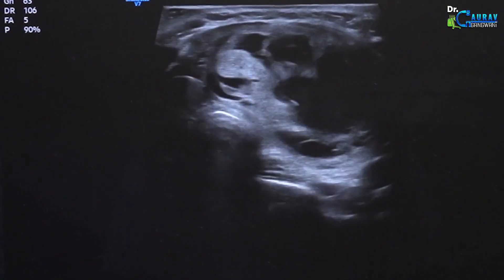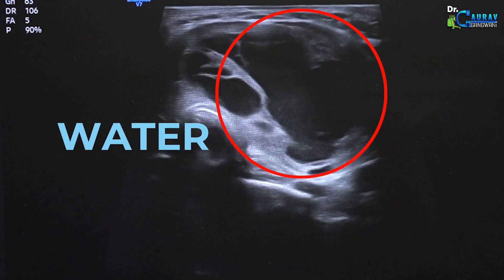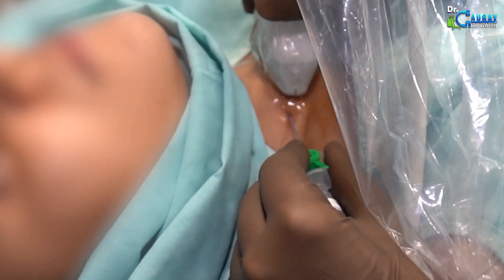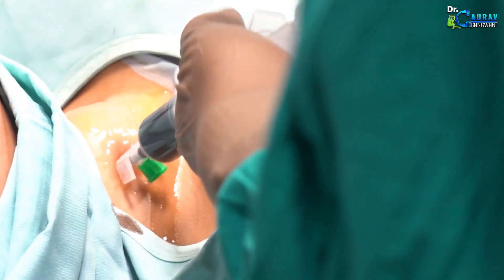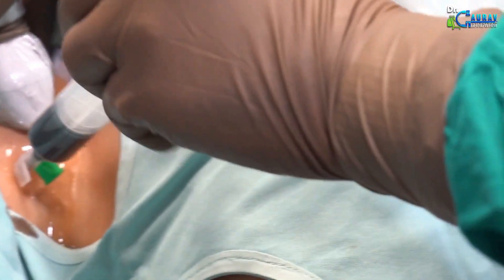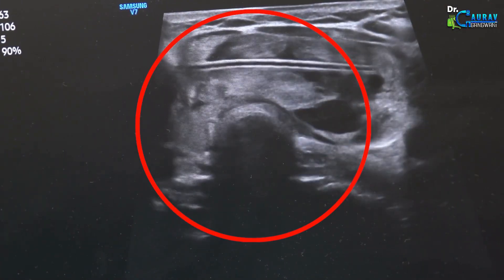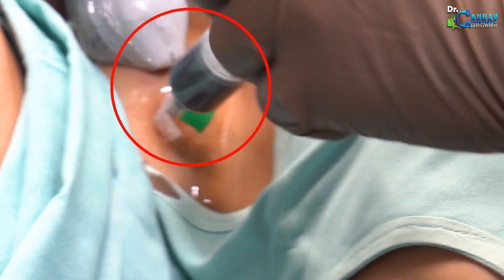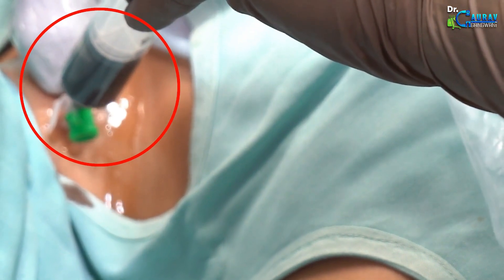There is a solid part, but the cystic or fluid part is also quite significant. Anything that appears completely pitch black on the ultrasound is fluid. So there is also old liquid, blood, or water in this nodule. First, we inserted the cannula and completely aspirated any old blood or liquid, meaning we suctioned it out and discarded that water. You will see how this black part is gradually decreasing. This is the classic colloid goiter — the colloid is indeed the water of that classic colloid. It is very thick, resembling a gelatinous accumulation of water.